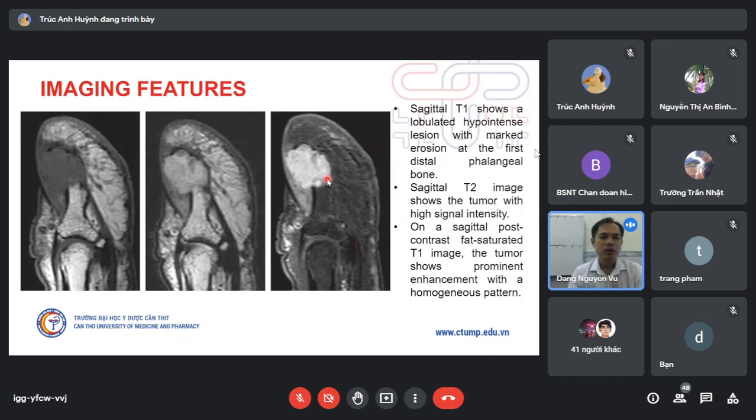You see the bone? In this lesion, I'm not sure whether there's any scalloping of the bone, of the distal phalanx. There's a disruption, an abrupt change of the axis of the bone of the phalanx, maybe because of the oblique cut. I'm not sure whether there's any scalloping of the lesion into the bone, which is one of the features. The lesion causes positive pressure into the bone and may cause scalloping. It's a benign lesion, but over time you can call it an indentation into the bone.